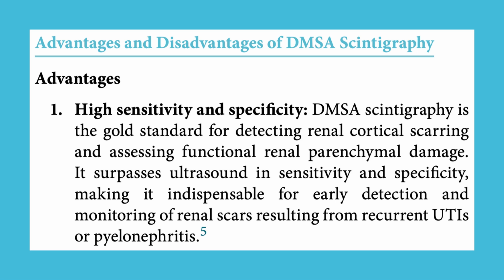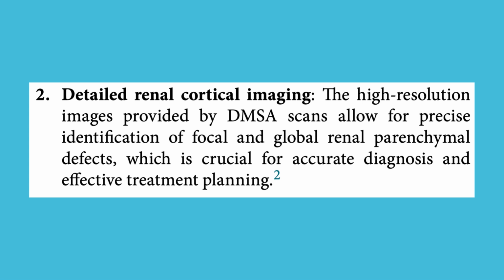Advantages and disadvantages of DMSA scintigraphy. Advantages. 1. High sensitivity and specificity. DMSA scintigraphy is the gold standard for detecting renal cortical scarring and assessing functional renal parenchymal damage. It surpasses ultrasound in sensitivity and specificity, making it indispensable for early detection and monitoring of renal scars resulting from recurrent UTIs or pyelonephritis.